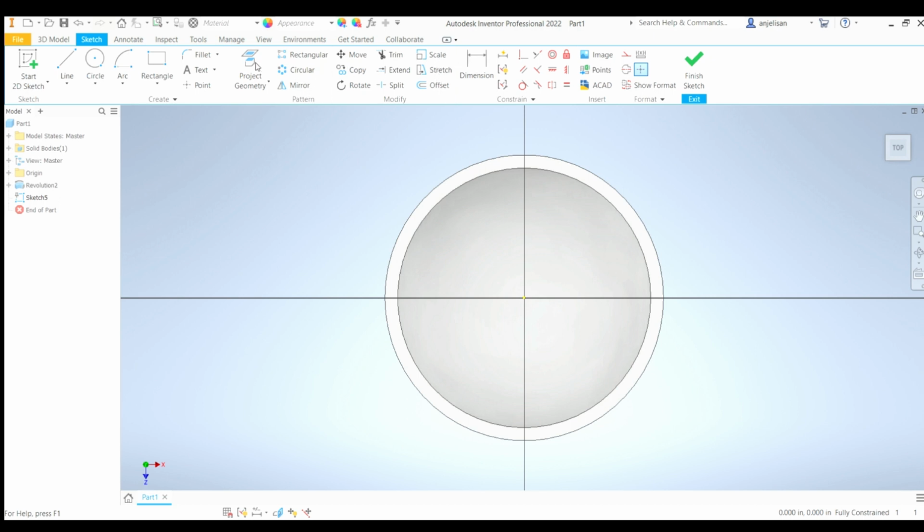Then what you want to do is you actually don't need to sketch anything at all. Hit project geometry, select the outer ring, and then the inner ring. A common mistake people made is that sometimes they selected this whole thing when they were really just trying to select the inner ring. Don't do that, because that just makes it select the whole circle, and we don't want that. We just want this face. I think alternatively you could just select this, as long as it's only highlighting the ring part. So yeah, that's fine. Now it's highlighted in yellow.